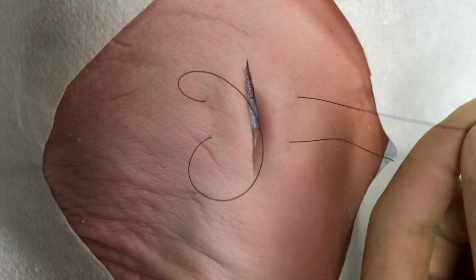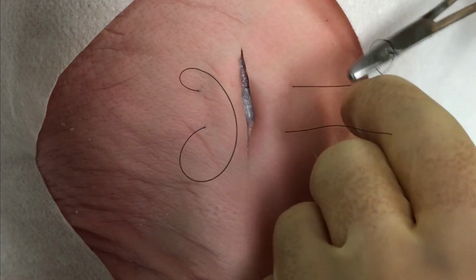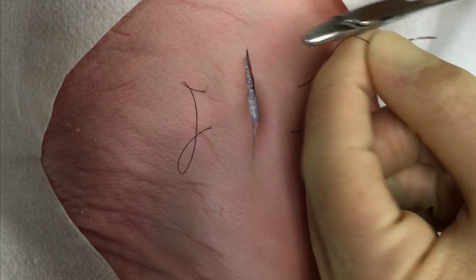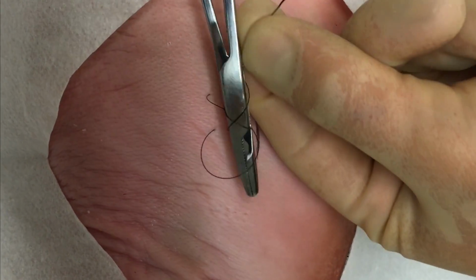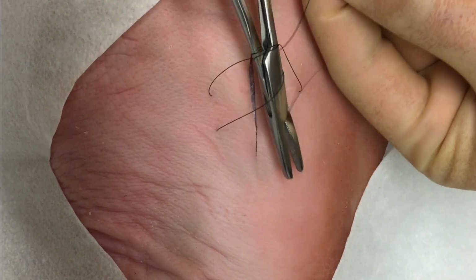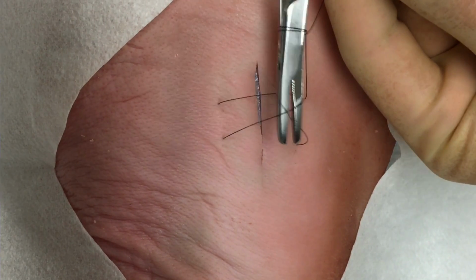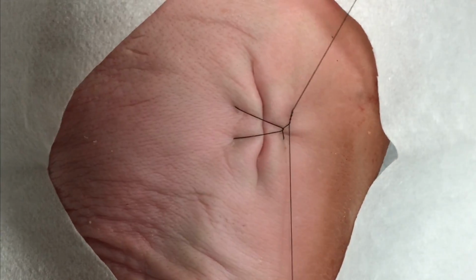Rather than dropping the needle through the center of the suture loop, you'll instead wrap the suture end with the needle still attached twice around your needle driver, and you'll pass your needle driver underneath that loop of suture, grabbing the free end of suture material and pulling it through, effectively tying your knot through the center of the loop.